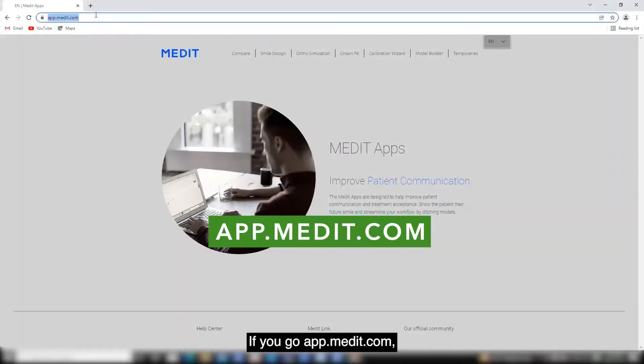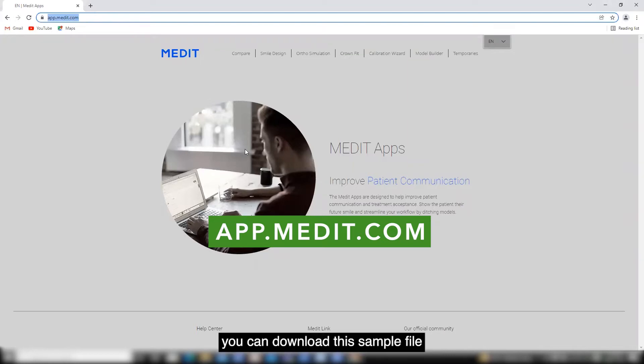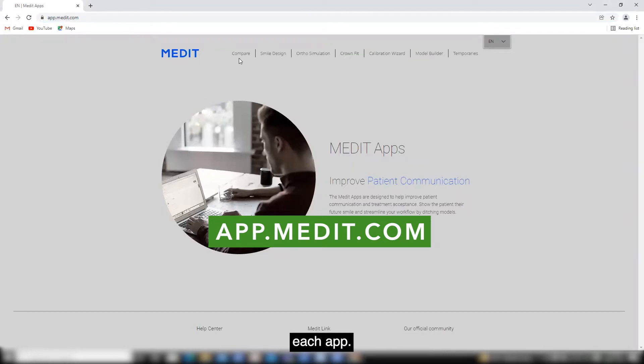If you go to app.medit.com, you can download some sample files for each app.